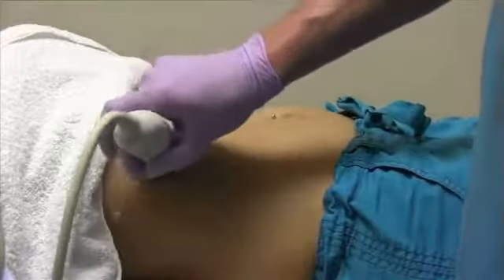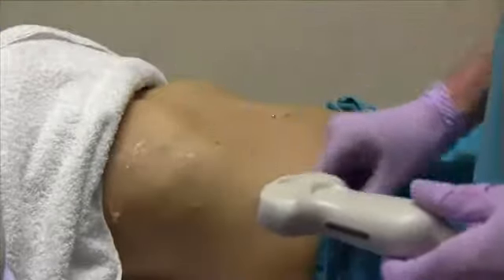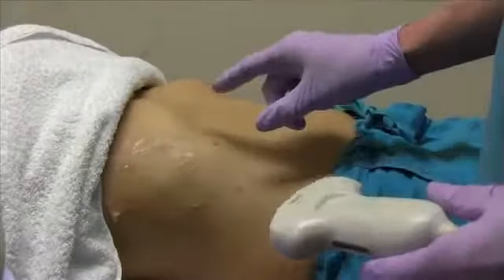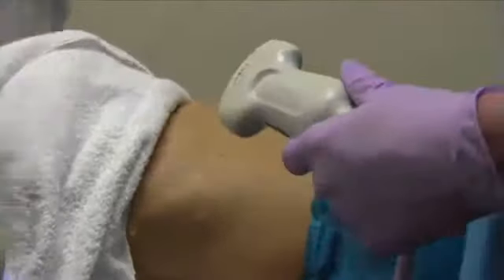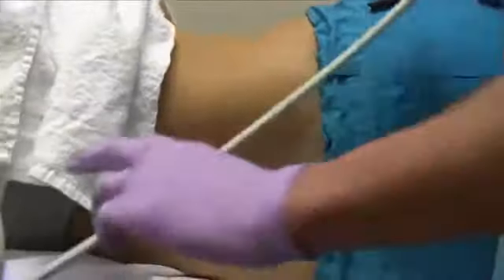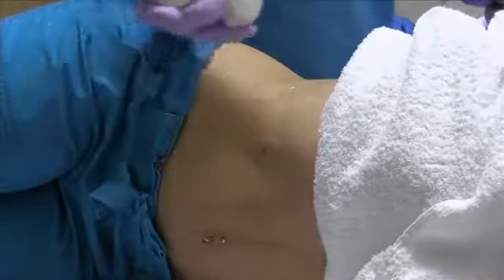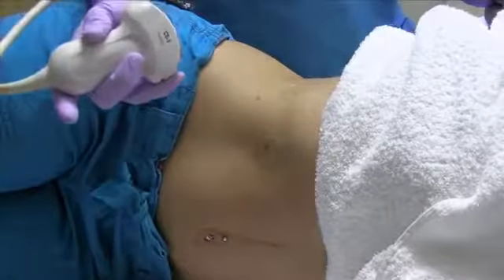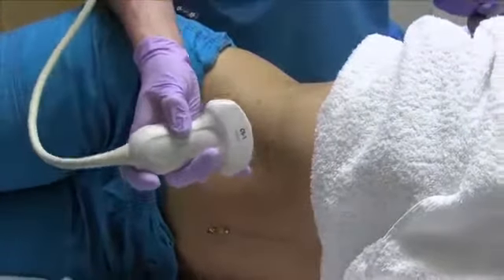For the gallbladder, we also get decubitus pictures just to make sure there's no stones trapped in the fundus or the neck of the gallbladder. So for that, I'm going to have you turn onto your left side away from us. For this, the gallbladder usually moves a little bit forward. After you get your supine pictures, you want to decube the patient to make sure there are no stones stuck in the neck of the gallbladder.